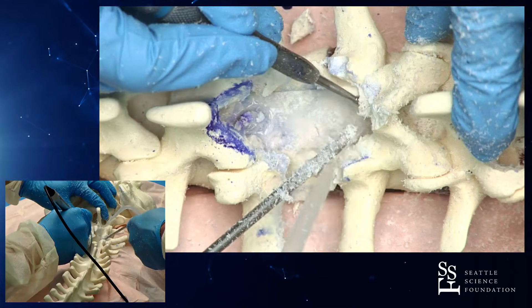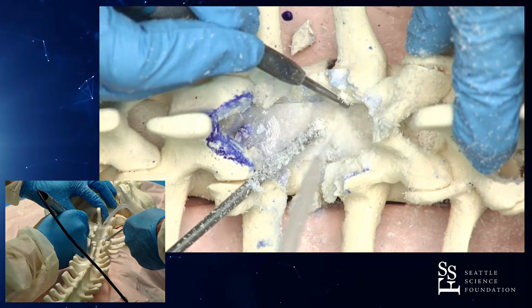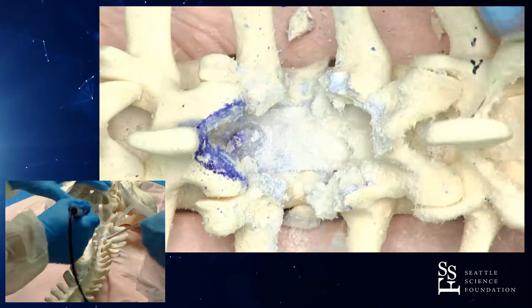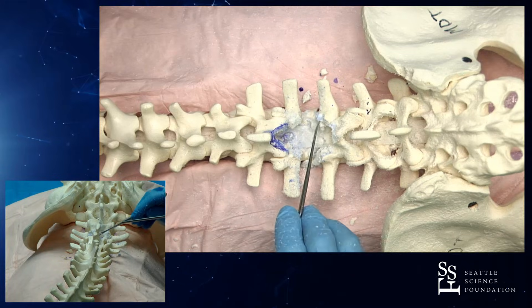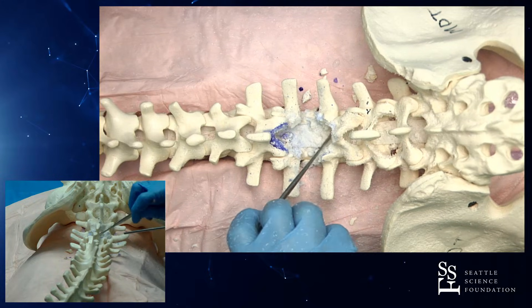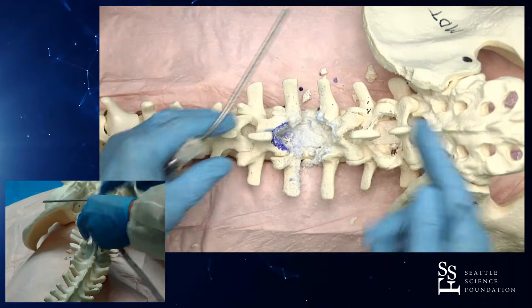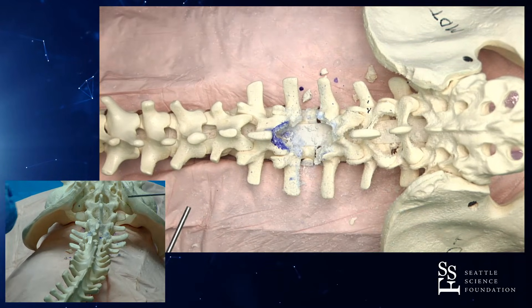Nice little chamfer cut there. And go all the way through now into the spinal canal. Sometimes you get a little bit into the pedicle, but you just medialize a little bit, Brooks. There you go. And now amputate the tip of the superarticular process — straight across the top of the pedicle. And what have we accomplished? Exiting nerve roots and exiting foramen are fully opened. Pedicle to pedicle. Roots below can be easily palpated. Ligamentum flavum has been removed. We have a beautiful passage space and we can easily probe the neural canal. The preparations are made for not just a further interbody fusion, but even osteotomy, as we will show.